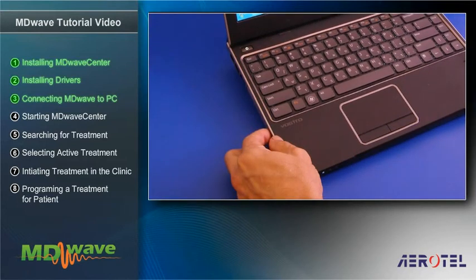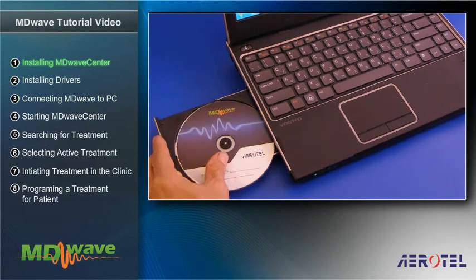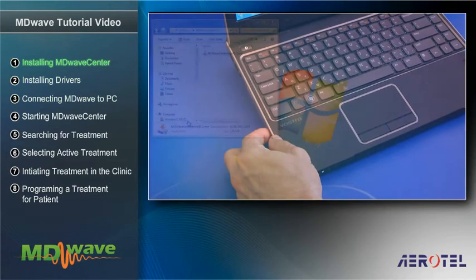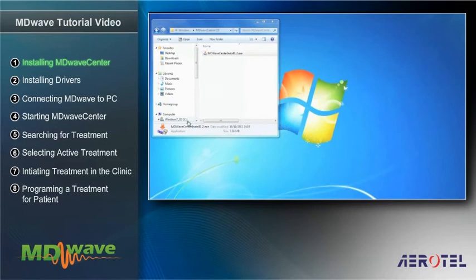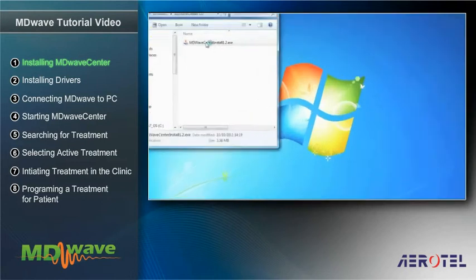In the first stage, insert the program disk into the computer's disk drive. The install program will usually operate automatically. If not, you can activate it manually by double-clicking the MDWaveCenter file.